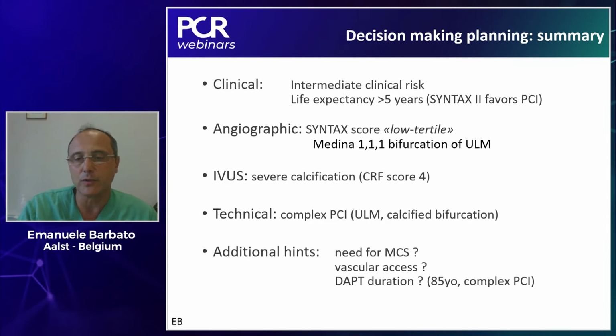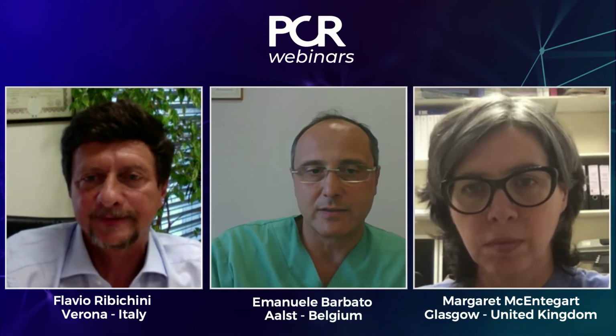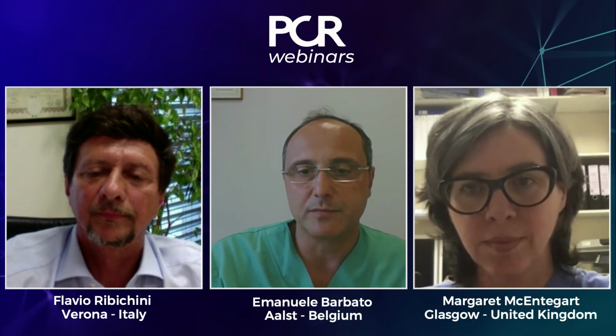need for mechanical cardiac support. It's open for discussion, but I would not do it, and we will hear the other colleagues, simply because there is a normal resting left ventricular function. I understand from Flavio that the hemodynamics of the patient is also well preserved. So in my opinion and in my experience, but also based on the evidences that we have, I don't think there is really the need for myocardial support. And I want to hear my colleagues on these last 2 points.